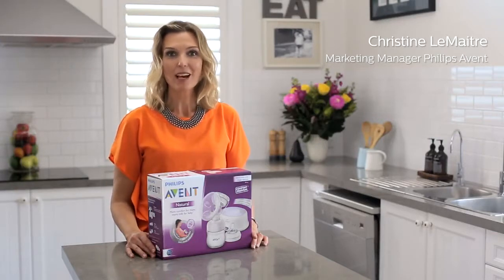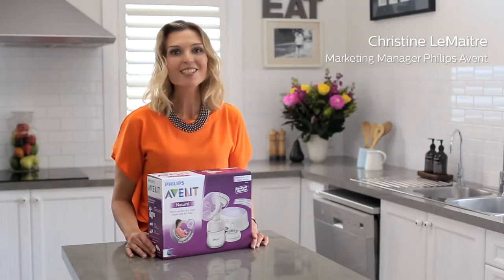Congratulations on buying your new Philips Avent single electric breast pump. I'm going to show you how to put it all together so you can get started quickly. Firstly, take all of the components out of the box one by one and remove them from their plastic bags.